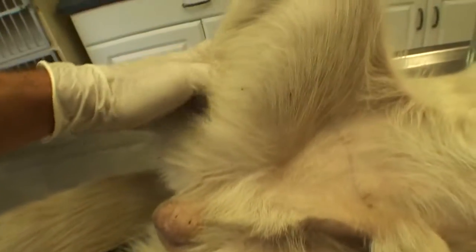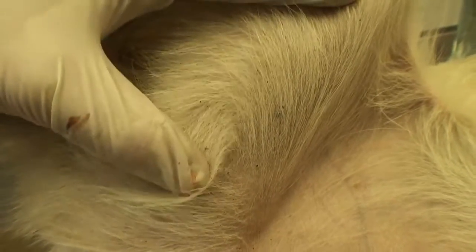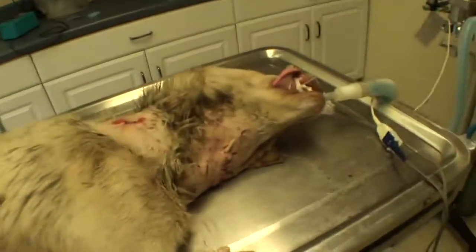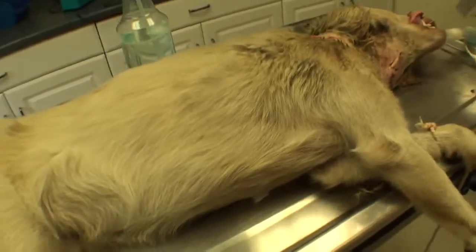Going to go ahead and neuter him now, and he has little fleas crawling everywhere, even though I gave him something to kind of get rid of some of the fleas. So when he's waking up from the neuter, I'll probably go ahead and give him a flea bath. He needs just a bath anyway, just all this dirt. But look, all this stuff that you can see in his hair, that is all flea dirt, just from fleas pooping in his hair. Nasty. He has big ticks on him too.